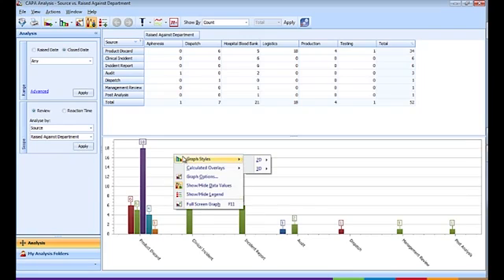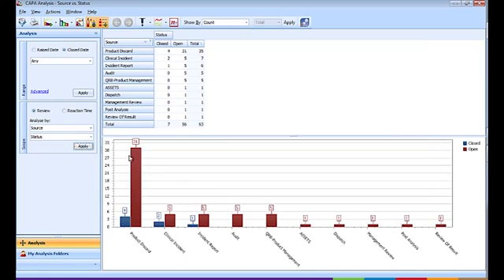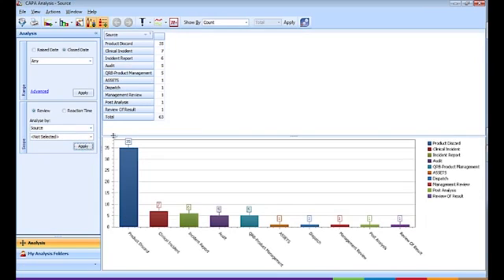You can see that we're able to view types of actions versus department. We can also choose the status. This will show records that are open, records that are closed. And you can see that the fields that were set as mandatory are pulling through. Okay, so let's have a look back at product discards. This is our top offender.